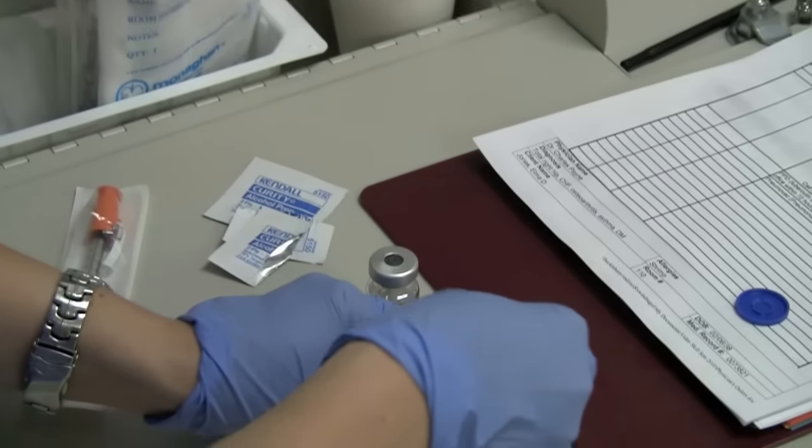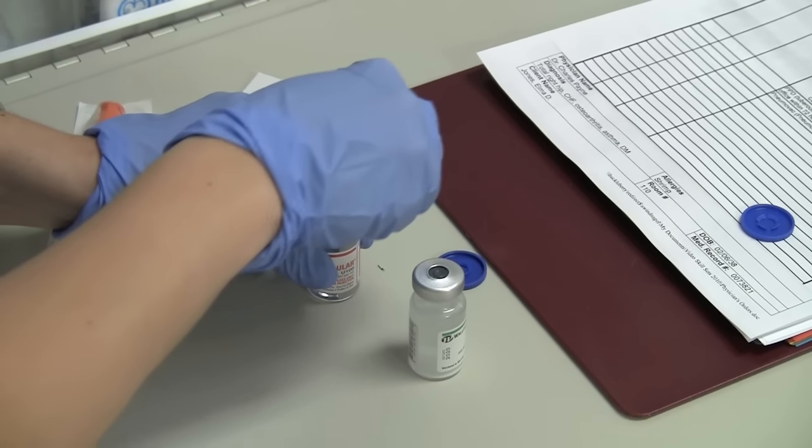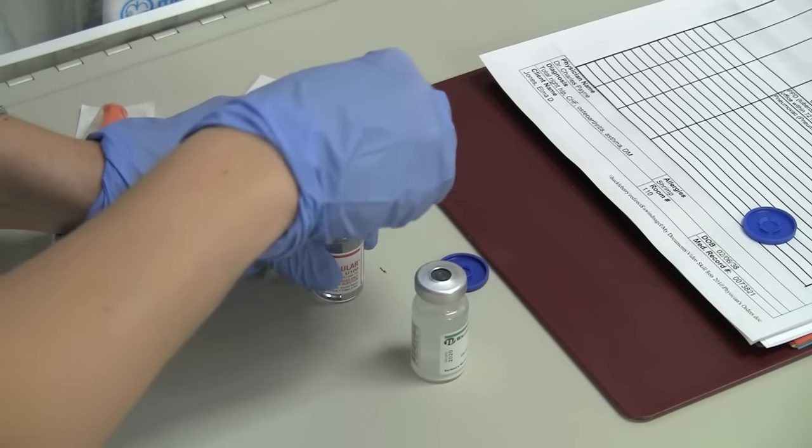Clean the tops of the vials with the antiseptic swab in a circular motion. I'll use the example of mixing 10 units of regular insulin and 30 units of NPH.